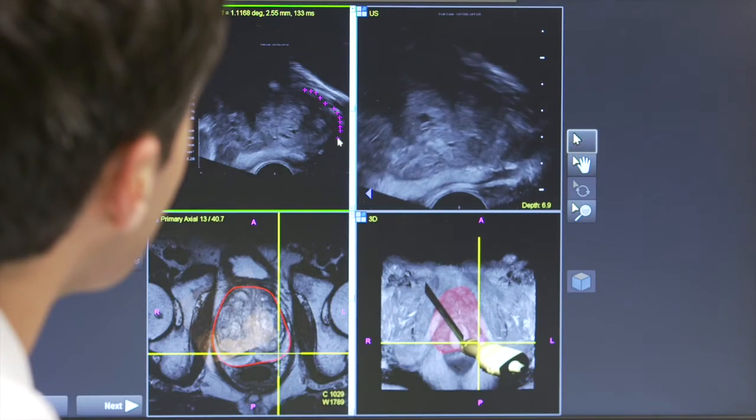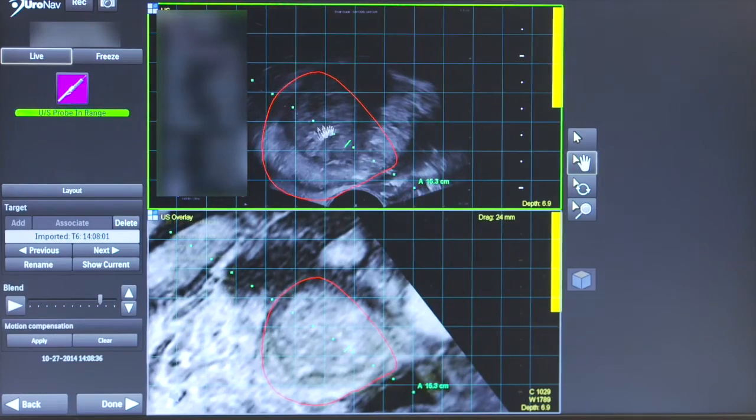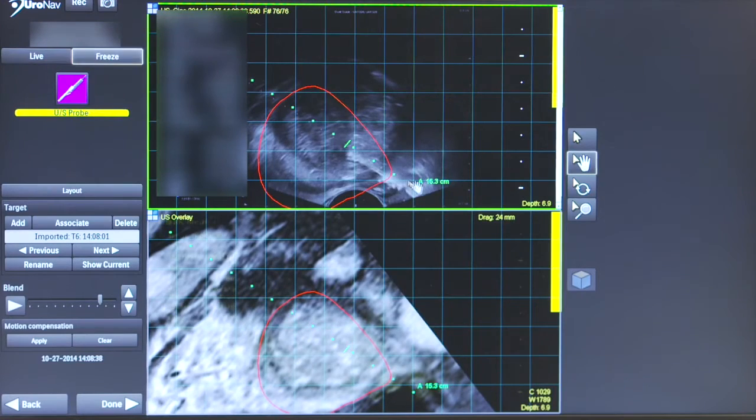And I think some of the misconceptions highlighted are that this is an office-based procedure. It doesn't require general anesthesia for patients to undergo this procedure. The local anesthesia we provide is very similar to what was provided previously for the last 20 to 30 years for patients to undergo this. So again, the patient experience for this biopsy is no different, but what we're doing behind the scenes, the software advances to be able to get a good target, a non-random, if you will, sampling of a patient's prostate to accurately stage their disease, is what's paramount in the difference between this and what has been done.